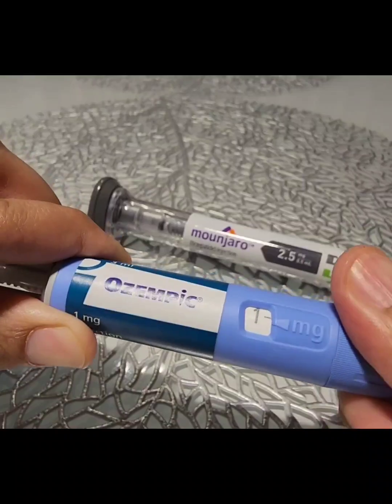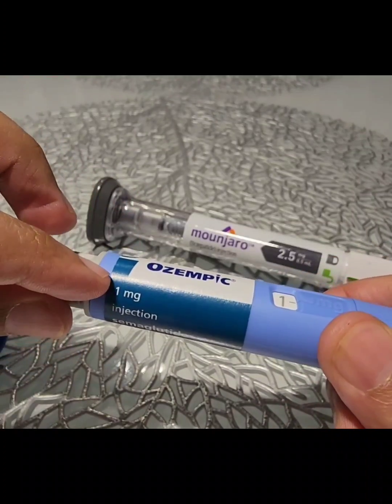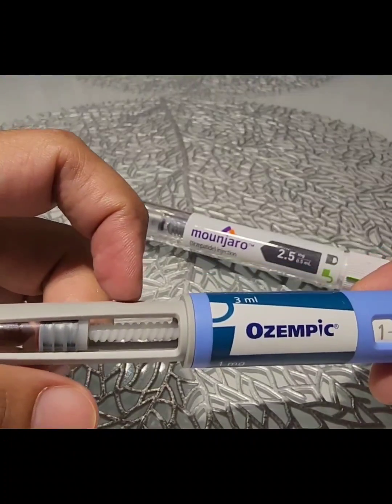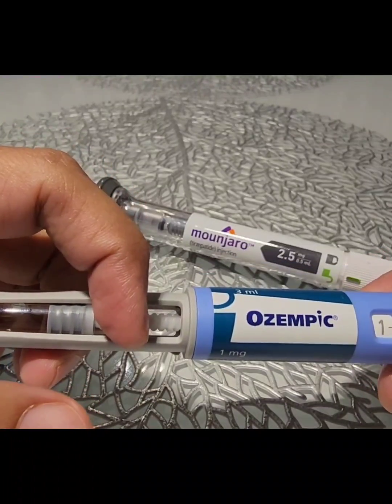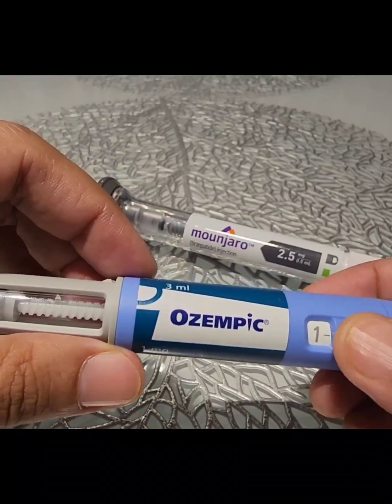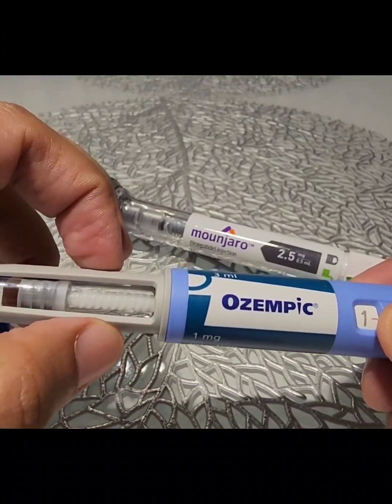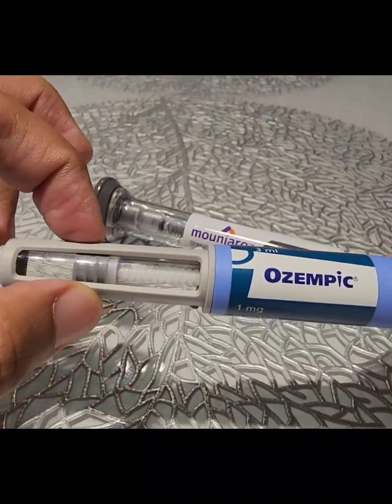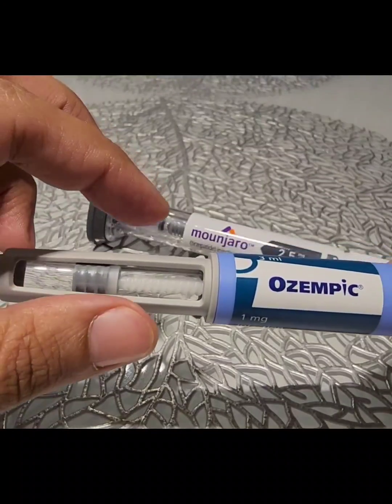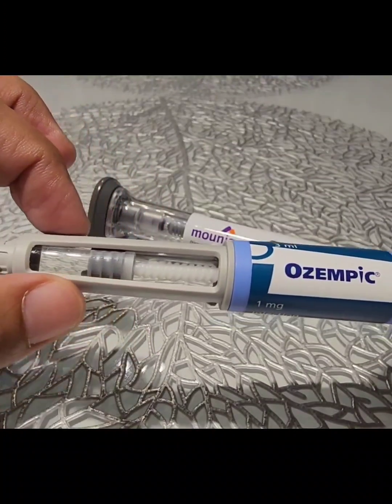As this is a one milligram pen, it can only administer a one milligram dose, which will actually be a quarter of the fluid in this cartridge. So when you have administered one milligram, you would actually be left with three-fourths of the pen, which means it will be taken for another three weeks.